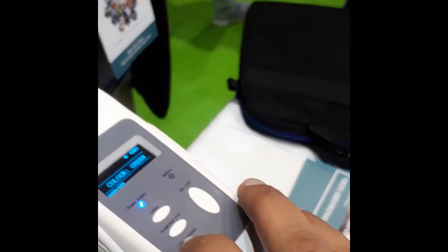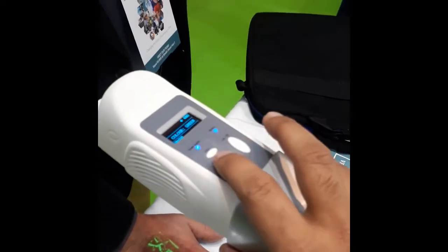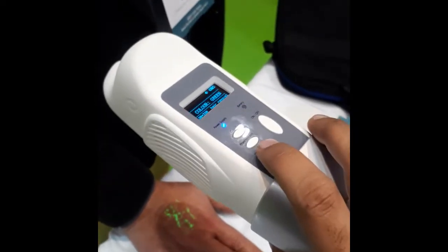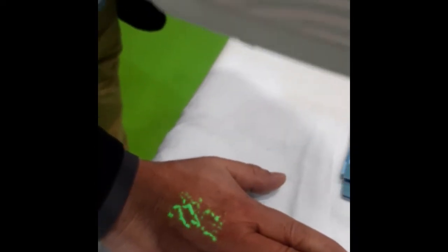You can adjust the projection size accordingly. There is a hair removal option as well, to remove the hair from the projected image. It's quite an interesting item.